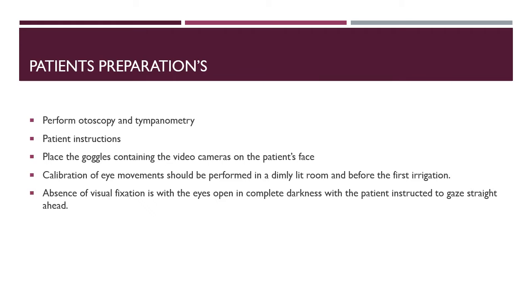Okay, now let's move on to how we perform the test. So first, we must perform the otoscopy examination and tympanometry to check the condition of the ear canal and tympanic membrane before we start the test. And we must make the patient as comfortable and as relaxed as possible. Then we give instructions to the patient.